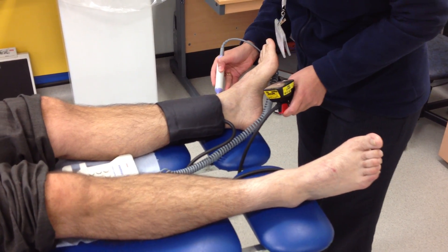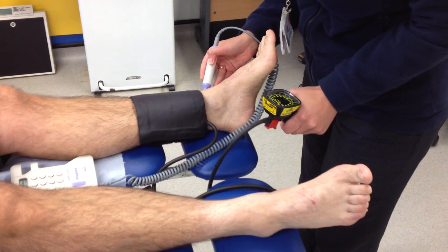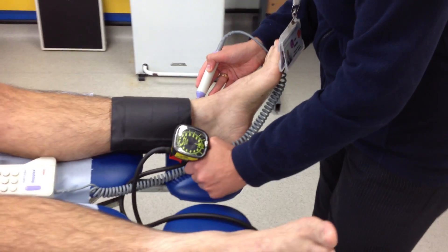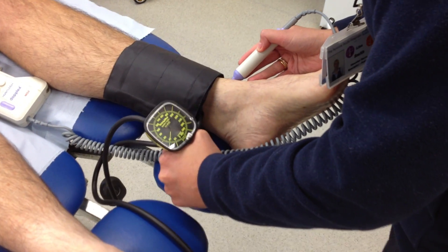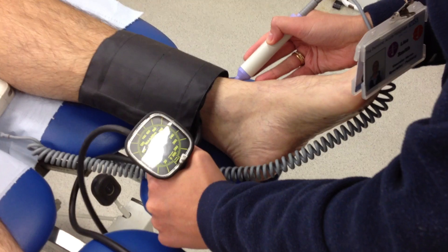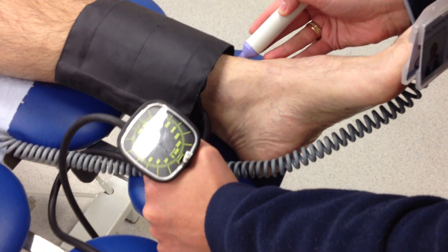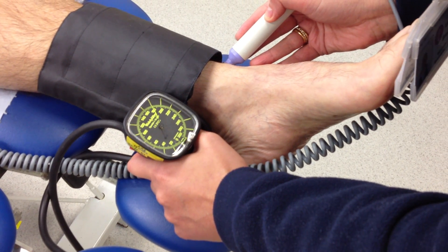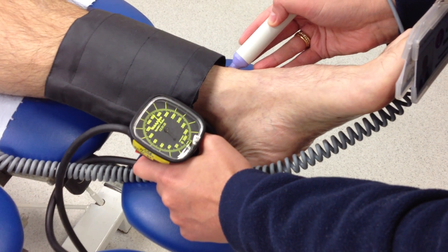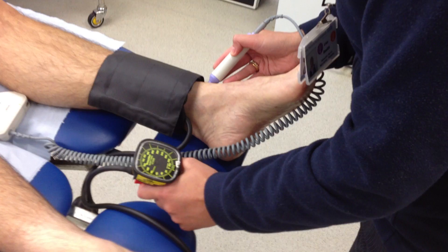The anterior tibial artery is located. The cuff is deflated slowly until the first audible signal is heard.